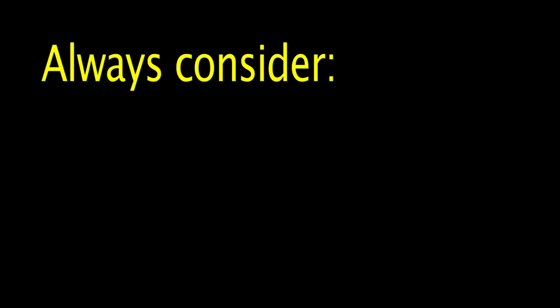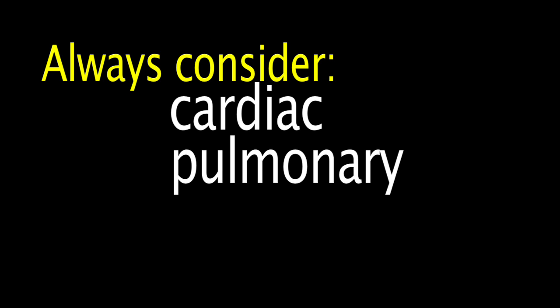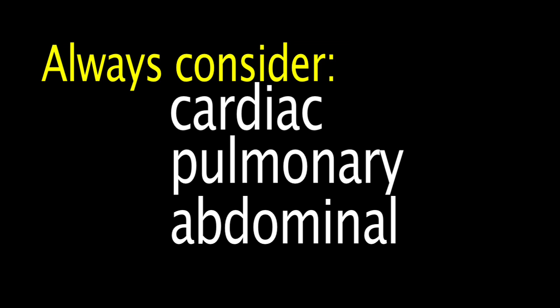Of course, even a diagnosed rib fracture does not completely exclude cardiac, pulmonary, and even abdominal pathology. But visualization of the fracture can make you more confident that you have isolated the source of the patient's pain.